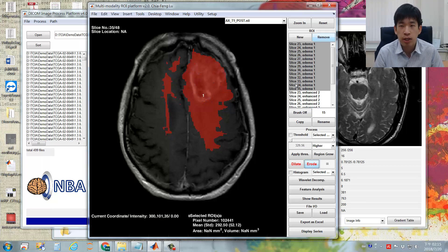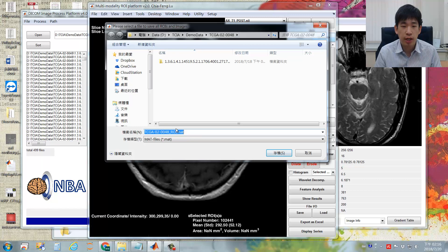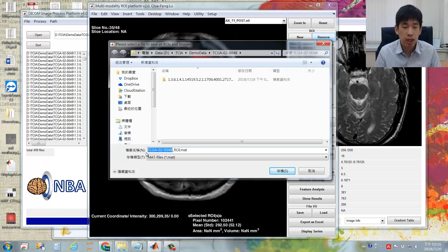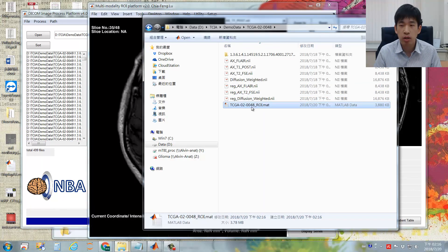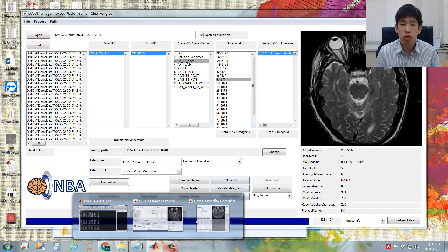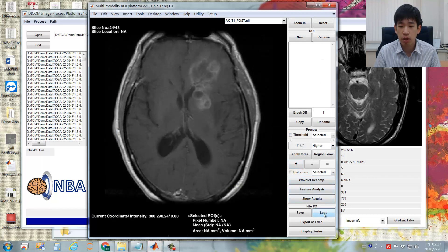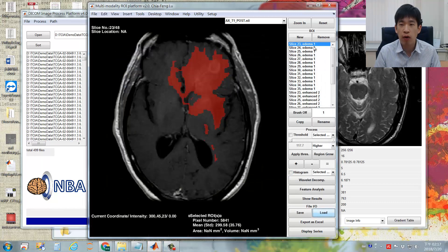All the designed ROI functions have now been introduced. Before calculating radiomic features, remember to save your ROIs by clicking the Save button. A pop-up window will ask you to assign a filename — it is recommended to use the default name combining the patient ID with the ROI label. Click Save, and a new file will be created in the subject folder. Next time you want to review or use the ROIs, open the Multi-ROI window, click the Load button, select the ROI file, and all the ROIs will appear in the ROI list.